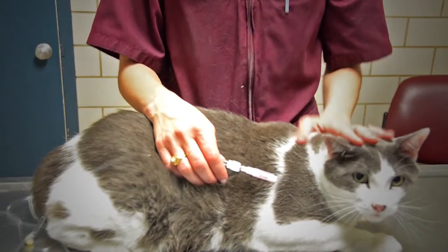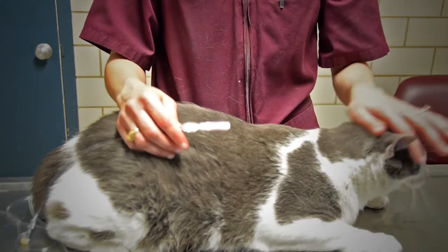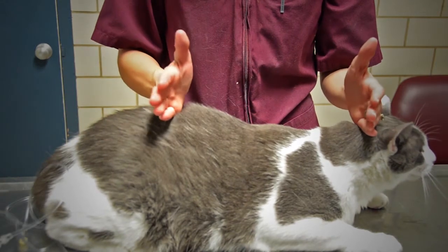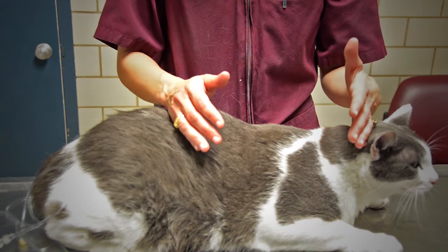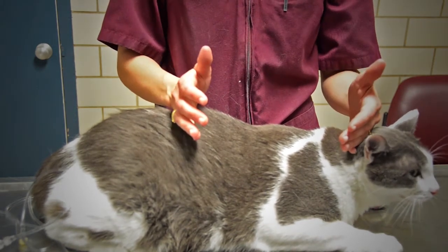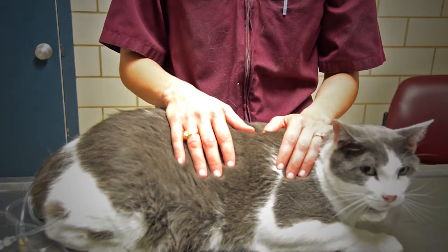So this is Skippy T. He's going to be your little helper today. Whenever you have your animal in front of you, you can basically administer the subcu fluids anywhere from here to about here. Most cats don't like this area being messed with. You can also administer it a little bit off to the side. It doesn't have to be right down the middle of the back.